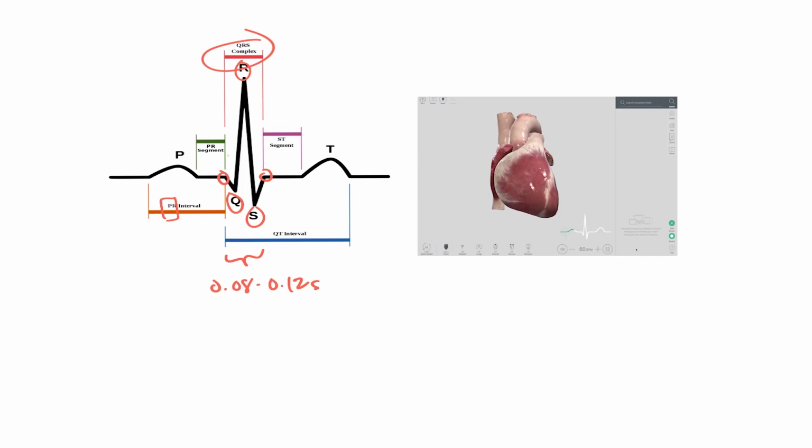This is pretty important because the QRS usually measures the ventricles. And we're going to talk about the different changes of the ventricles, whether they get bigger or smaller. It'll definitely let you know whether or not the rhythm is shockable, because usually the only shockable rhythms are ventricular fibrillation and ventricular tachycardia. So VTach and VFib. There was one more that was shockable as well, but I forgot that. Anyway, those are the two main ones, and those relate to the ventricles.